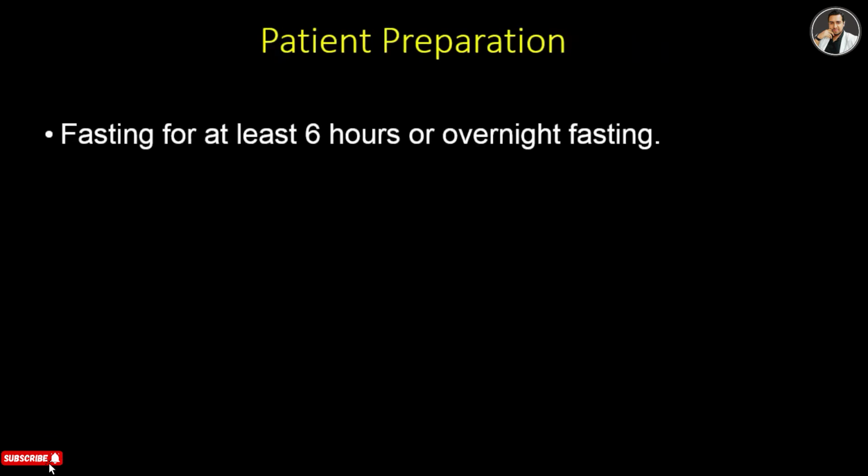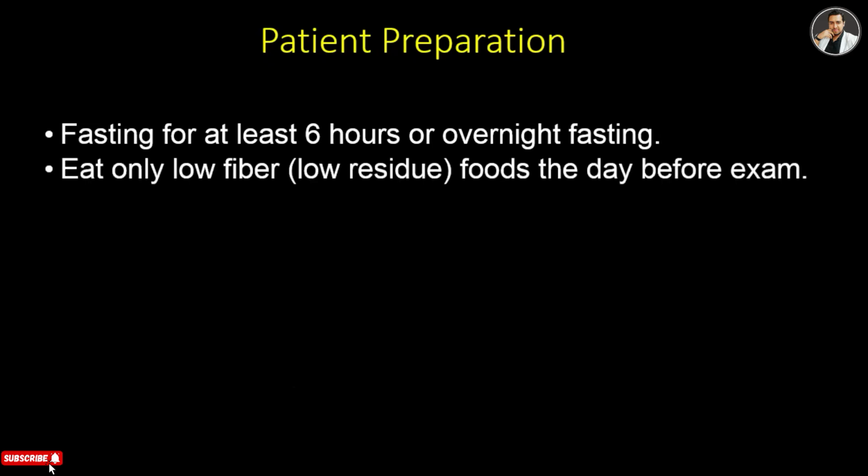And now the patient preparation for barium follow through procedure. Fasting for 6 hours or overnight fasting is necessary. It's best to ask the patient to take overnight fasting. So take dinner at night and then keep fasting at night and in the morning, and then come to the hospital fasting, and eat only a low fiber residue diet the day before the exam.